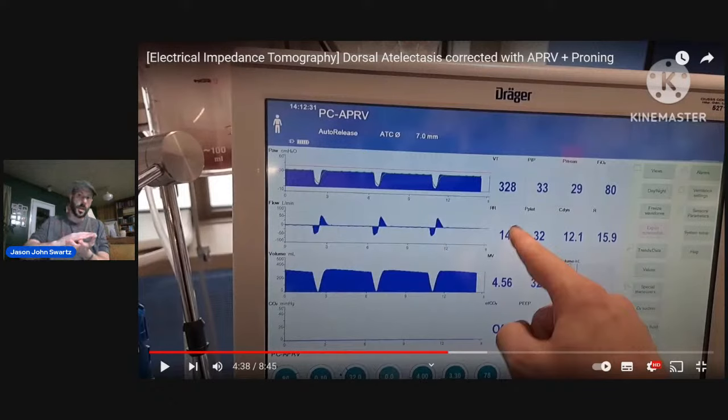I was able to do a trial of 30 P high, 32, and 34. I did that with PulmoVista and checked the regional compliance, and at 34 there was no evidence of loss of compliance compared to 30. There was, in fact, a slight improvement. I didn't feel it necessary to put it at 34. At 30, she had 8 cc's per kilogram of tidal volume.